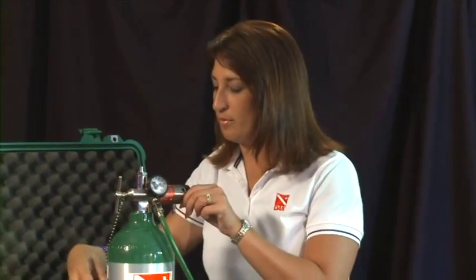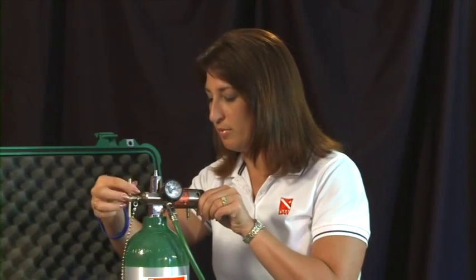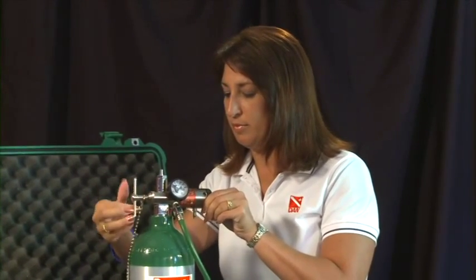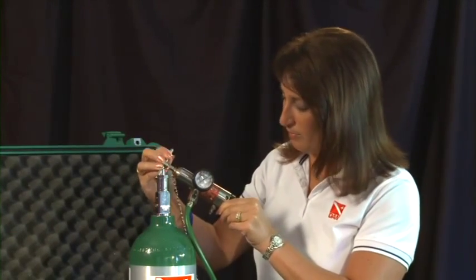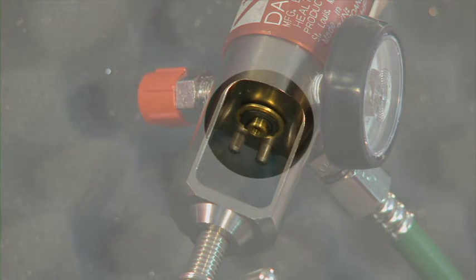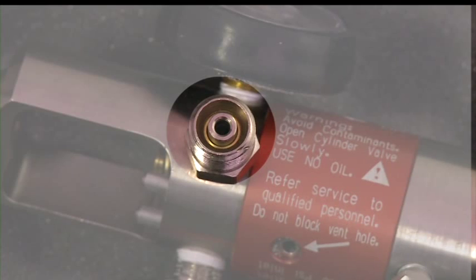Remove the multifunction regulator from the cylinder valve and note the system by which the valve and regulator attach. If your system leaks, check the oxygen washer to be sure that it's free of debris and other scarring that might cause it to not seal properly. Note that the washer is different than a scuba system o-ring, and that check valves on the multifunction regulator prevent oxygen from flowing out of the outlet ports when hoses are not attached.